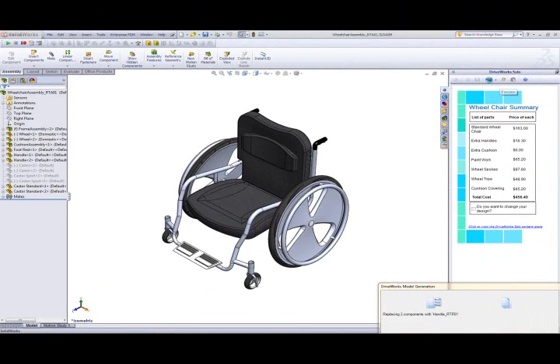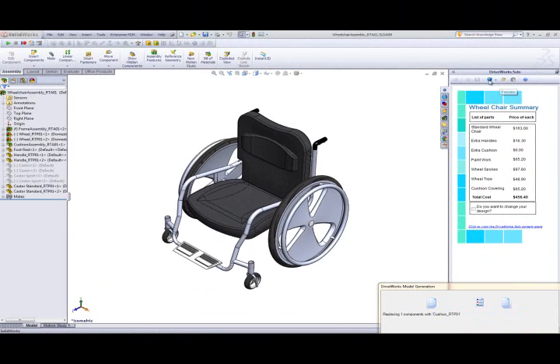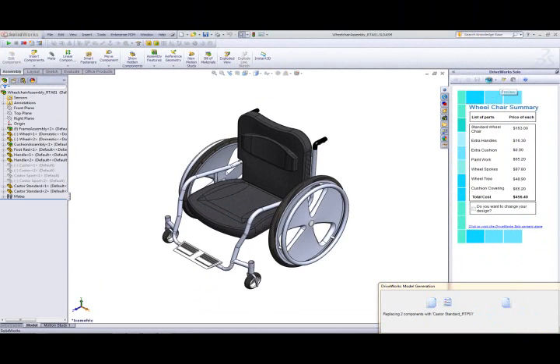By selecting preview, DriveWorks Solo will generate the model. Doing so will apply temporary file names to a copy of the master model and drive the dimensions and properties of the model to the values that we have chosen in our forms.